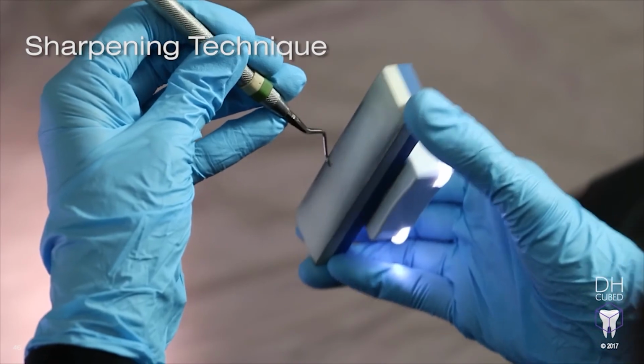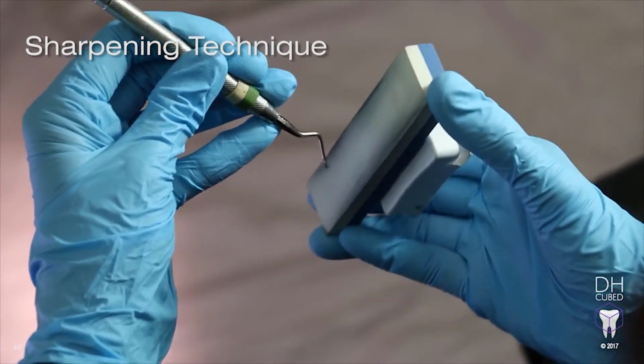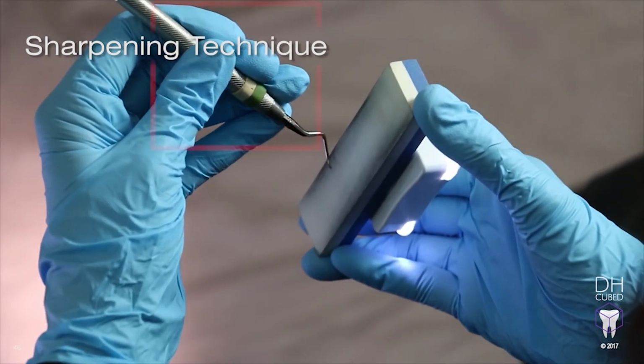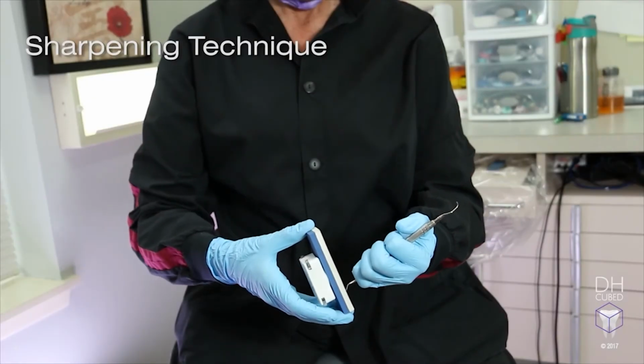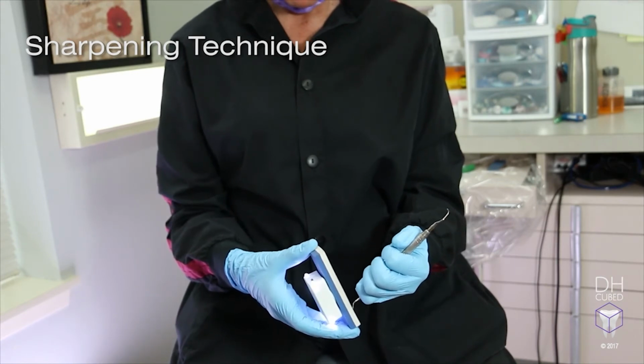When the instrument is not held correctly or firmly enough, it can shift, potentially causing bevels to form on the lateral surface. Look at where the thumb is located and how the fingers are not holding the instrument firmly enough. In order to prevent this, stabilize the instrument by using a firm grasp so that you won't shift due to the pressure used during sharpening. One way to stabilize your instrument is by anchoring your elbows against your body for stability. This will help prevent shifting of the instrument while sharpening.